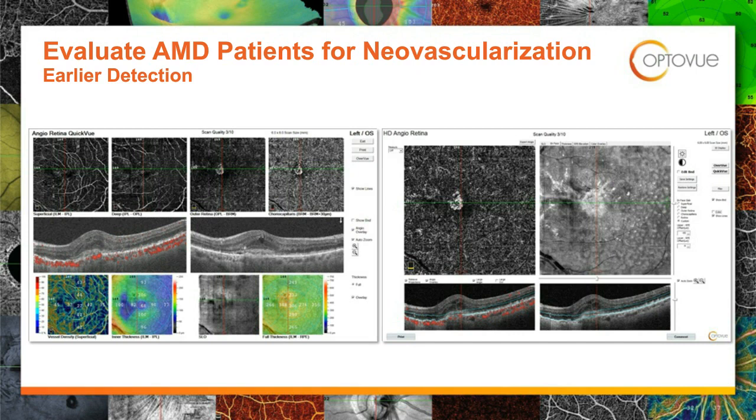Now, the 2 images below, the image on the left is showing the blood flow activity. And if you look at that middle B scan, you can see all the red on the left side there. That's the choriocapillaris. We expect blood flow to be there. Then you see it disappear, and then you kind of see it raise up into that hyperreflective cavity there. That hyperreflective cavity, when you see hyperreflective, that's a really strong indicator that that could be a choroidal neovascular membrane. And then right below it, you could see the blood activity. That's an active choroidal neovascular membrane.